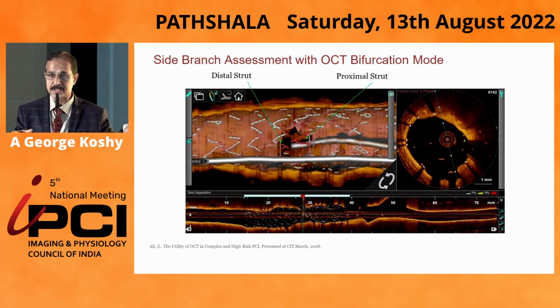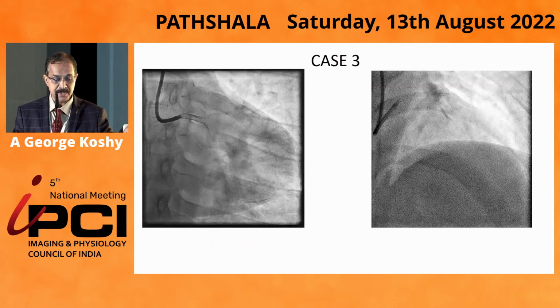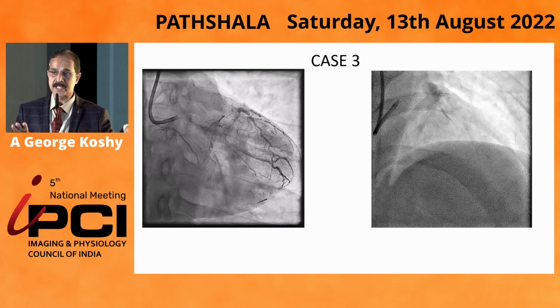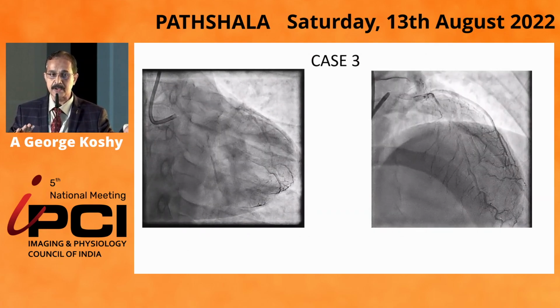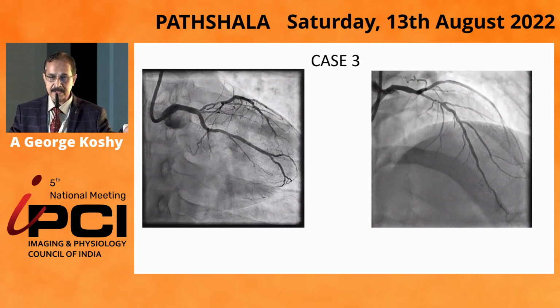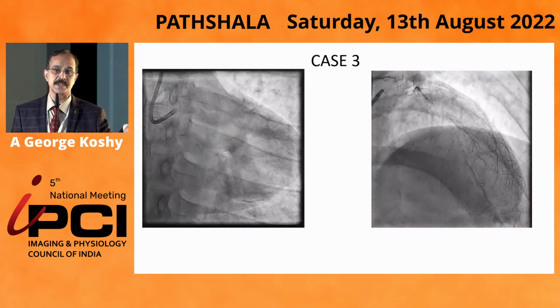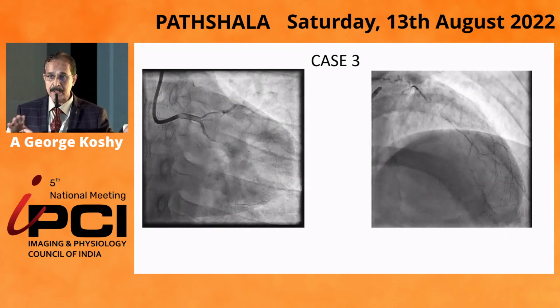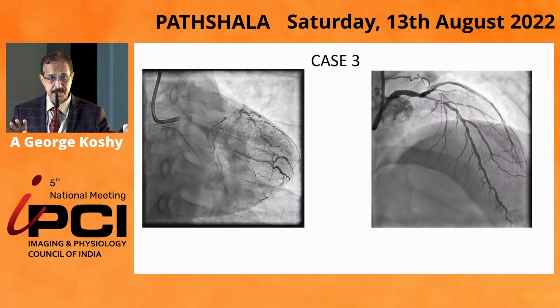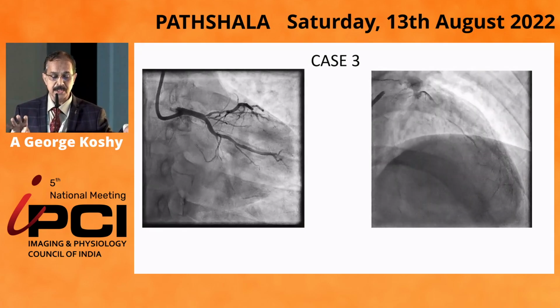And here, the distal strut as well as the proximal struts are there across that ostium. And this was discussed in detail by Dr. Ankush Gupta today as to what should be done for that. And the excess of struts projecting can later get endothelialized and can compromise the blood flow, and they can come back with restenosis. That's an important issue when you do this stenting from LM to LAD. The circ ostium is the usual one which creates problem.